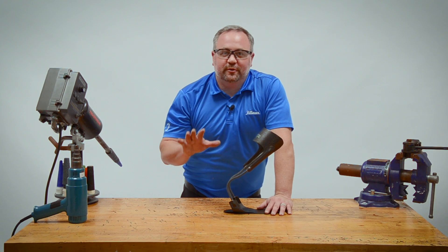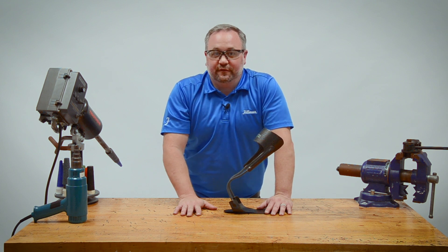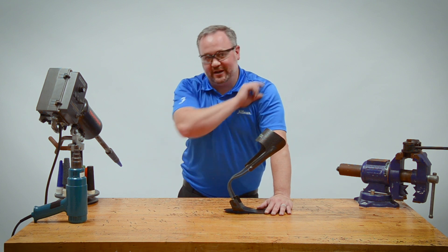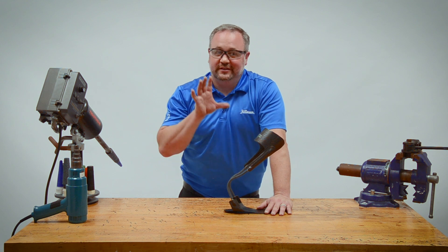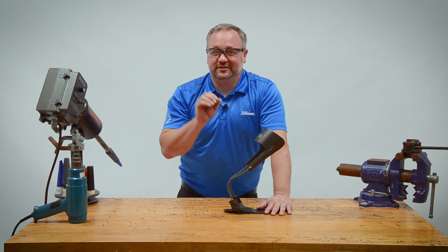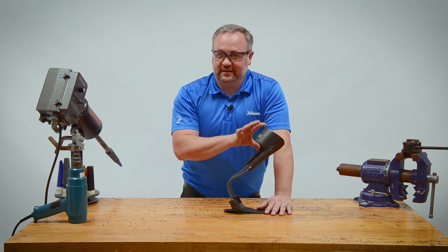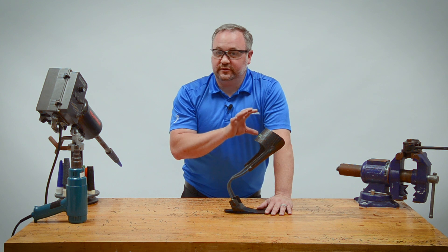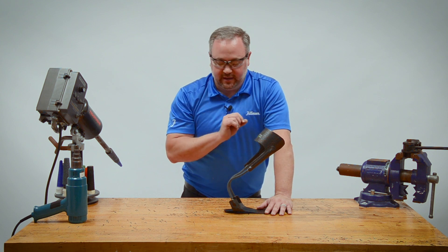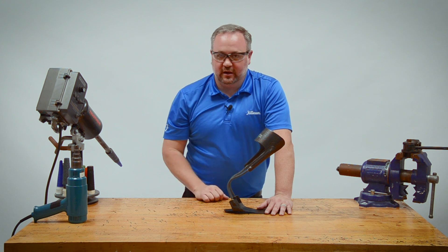One of the questions we get pretty often here at Fillauer is: how do I adjust a dynamic walk AFO? That's if people know you can actually adjust it. The nice thing is dynamic walk AFOs are made of a material we call TFC, which is our thermoformable composite, so I can actually remold it slightly if I really need to — for example, if I need to flare it for a patient. I'm going to show you what to do and what not to do when you go to adjust these things.